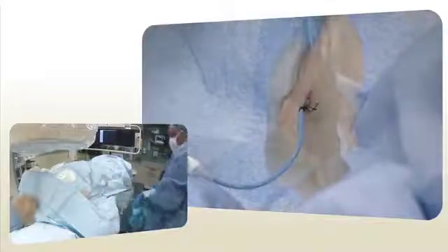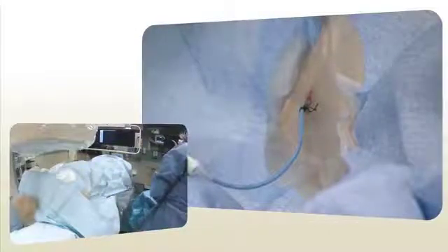The patient initially presented with pancreatic cancer and an indwelling internal biliary drainage catheter. The patient was prepped in the supine position on the procedural table.